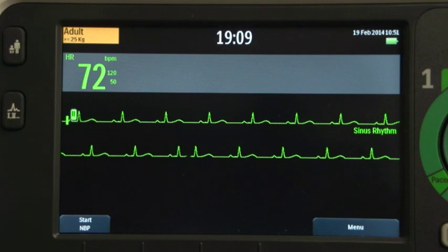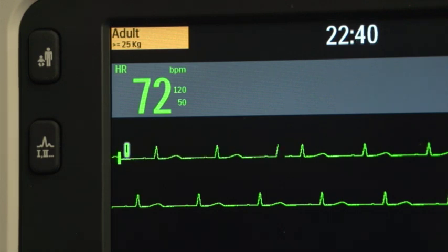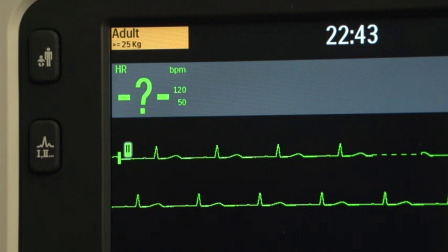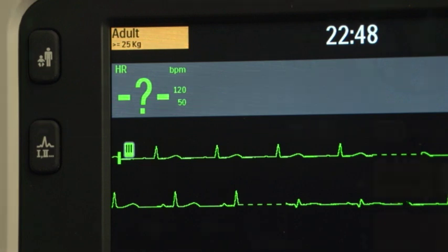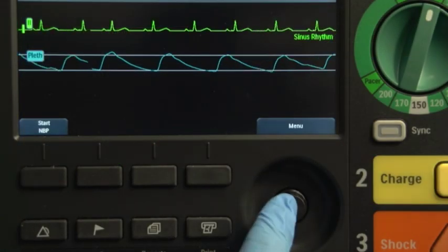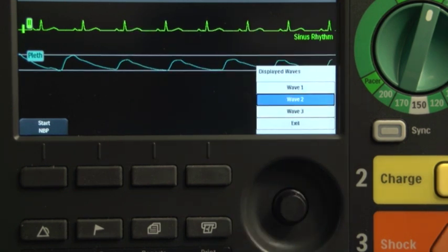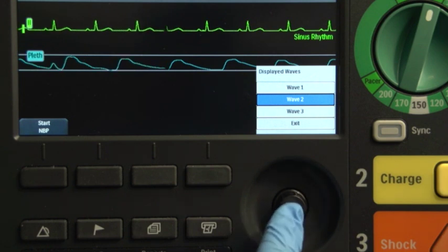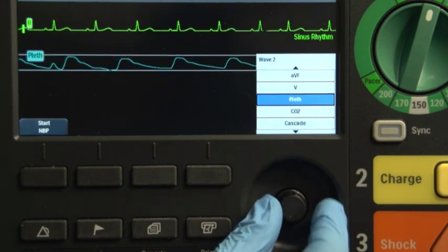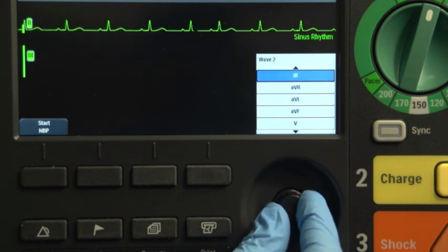How to change a waveform differs depending on whether you are in AED mode or not. In non-AED mode, the ECG wave for WaveSector 1 is selected through the lead select button or through the displayed waves menu. To change the waveform displayed in WaveSector 2 or 3, press the Smart Select knob. Navigate to displayed waves and press the Smart Select knob. Select the desired wave sector, press the Smart Select knob, and select the new wave type and press the Smart Select knob.